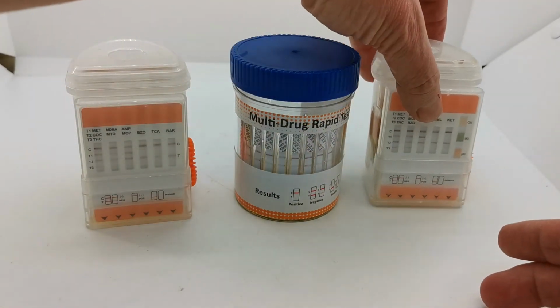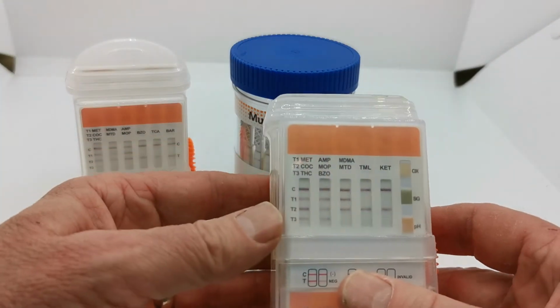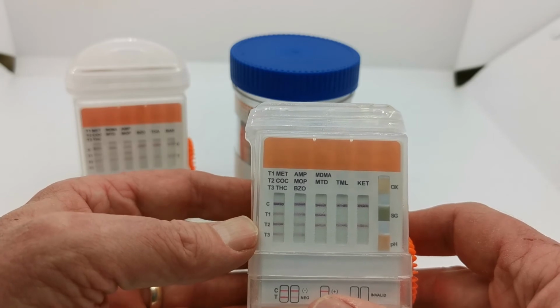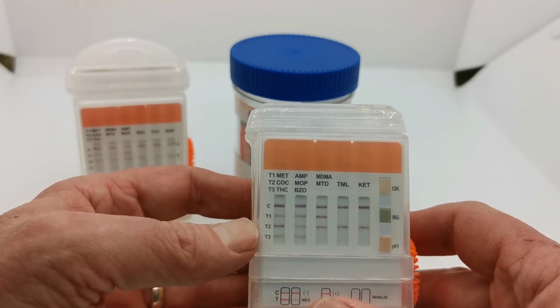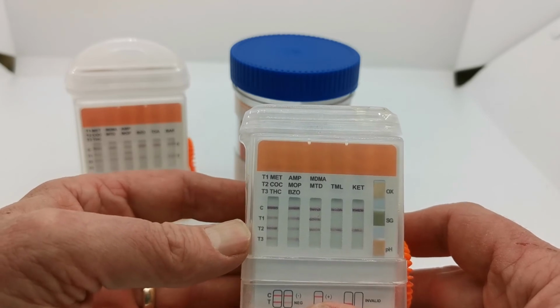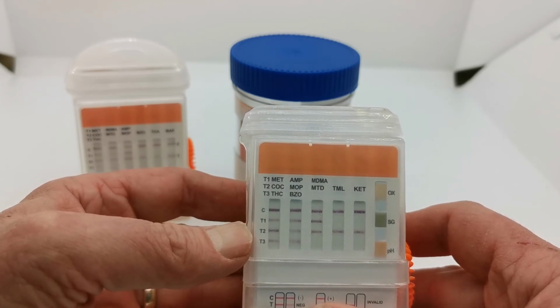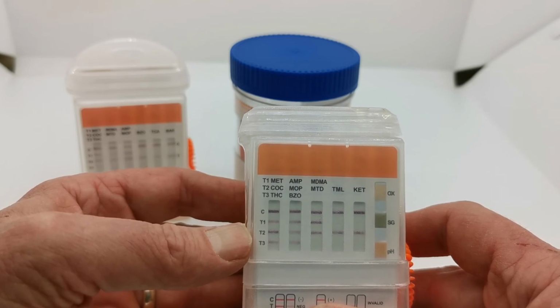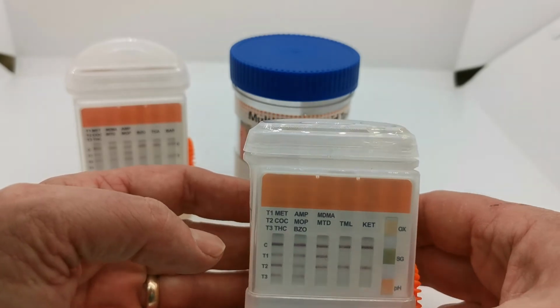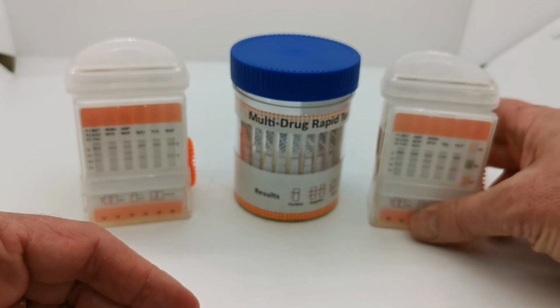Another example here. Again, almost all the test lines are thinner or fainter than the comparable C lines. That is of no significance whatsoever. All test lines, thin, faint or partial, in the presence of a control line, are an absolute negative for the drug group tested, and the interpretation must be on that grounds.